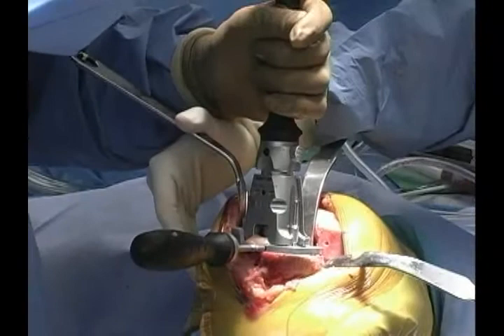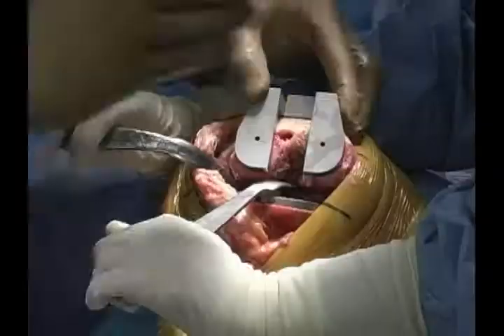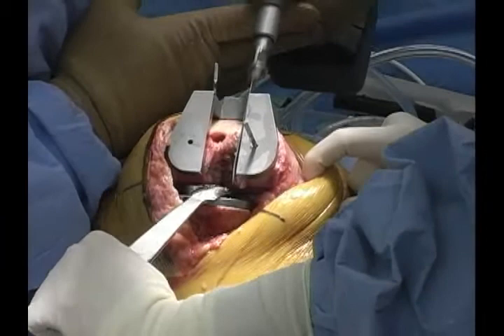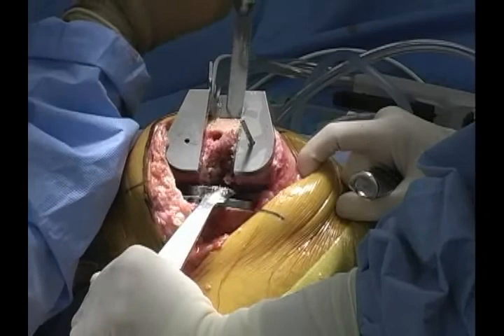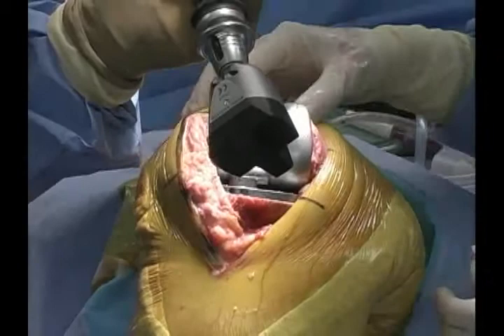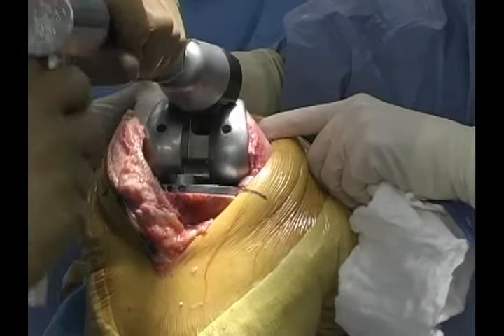Unlike the old two-piece insertion system, this is a one-piece insertion that also serves as the trial. This femoral impactor allows you to impact in the notch and force the femoral component into extension. We'll first impact straight on, then flip the impactor over and tap the knee — it tends to posteriorly stabilize. Femoral components tend to go on in slight flexion, and then you can re-tap. We've now placed the tibial insert.